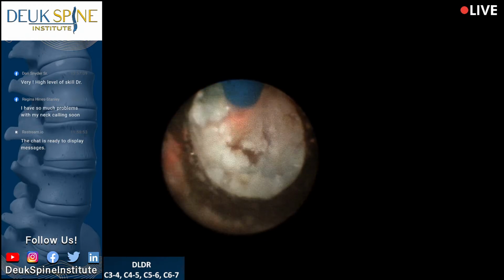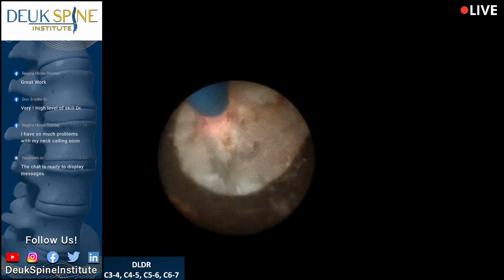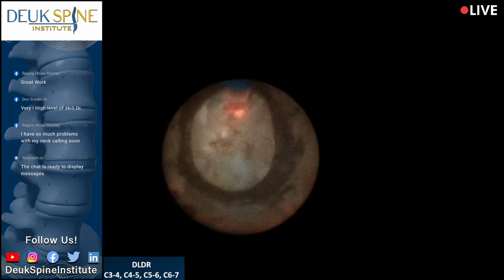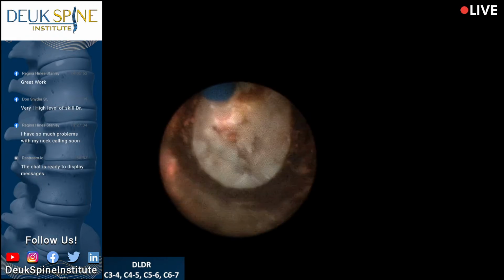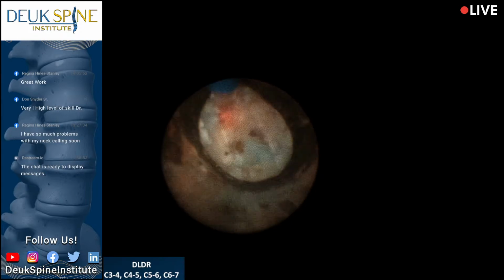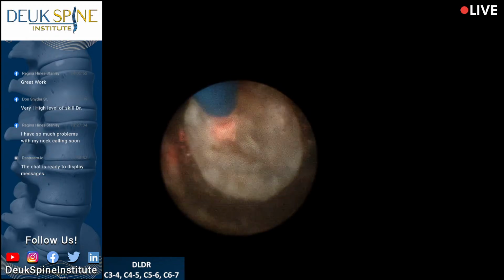Oh, look at that little herniation down there, just sticking his head out like a little gopher. Okay, so disc number 2. We're on our way. Again, no movement. Absolutely no movement of these bones. And we're going to change that. We're going to give them about 2 degrees of movement by the time we're done. That's my guesstimation.